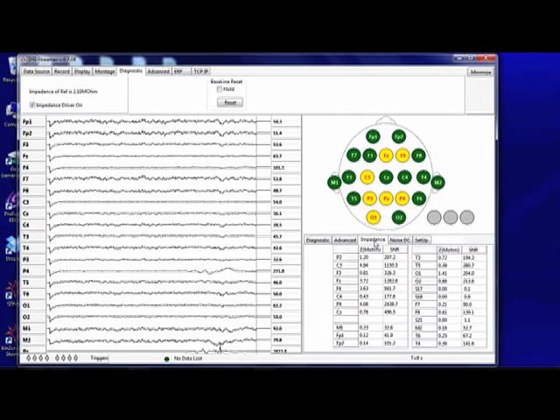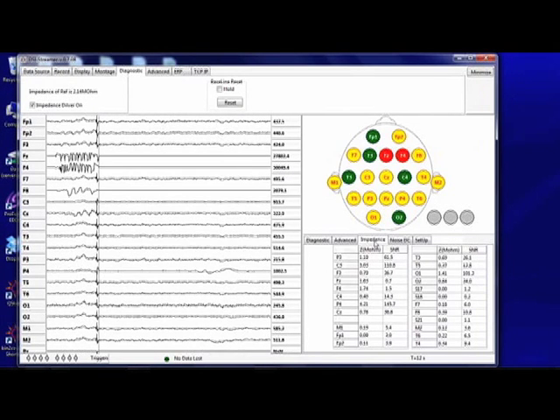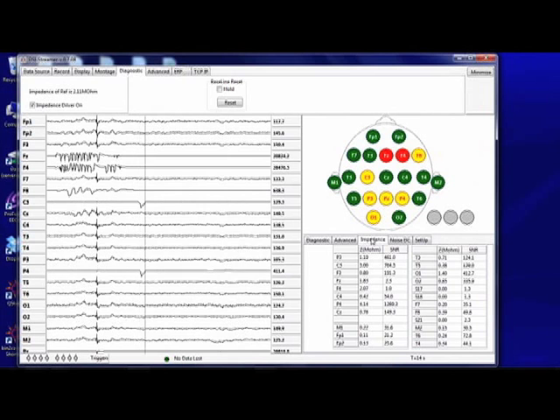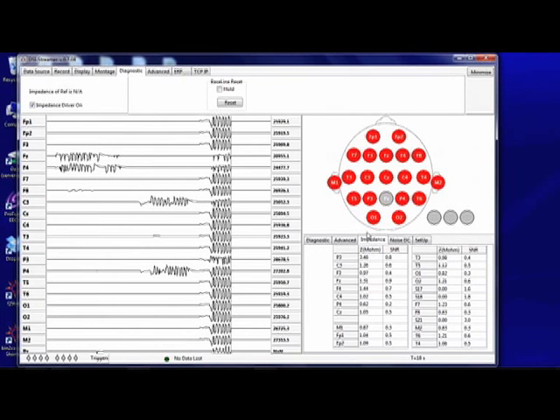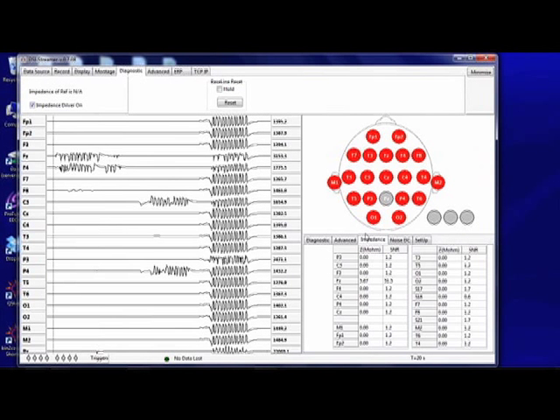During manipulation, sensors will saturate and will be seen briefly to go red on the display. Similarly, when the reference sensor is manipulated, all sensors will go red. Press the reset button to reset the amplifiers and then allow the sensors to settle for 10 to 30 seconds before manipulating the sensors again.